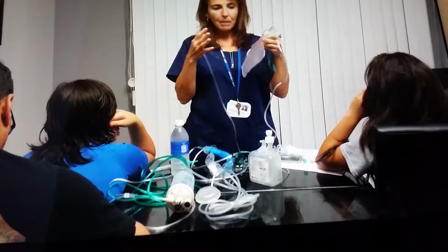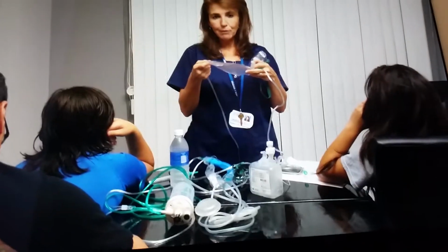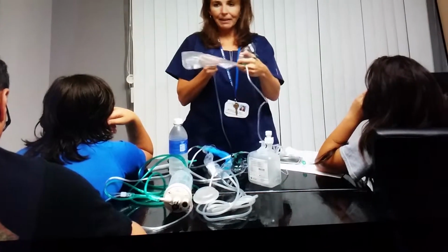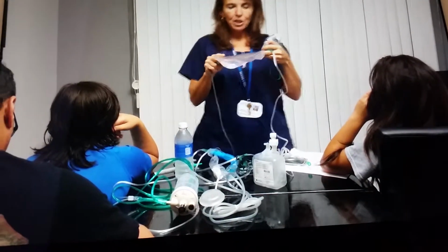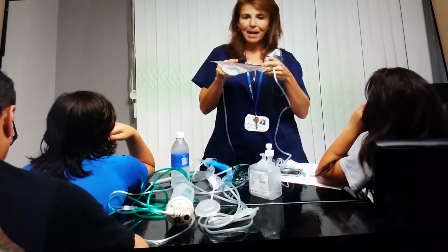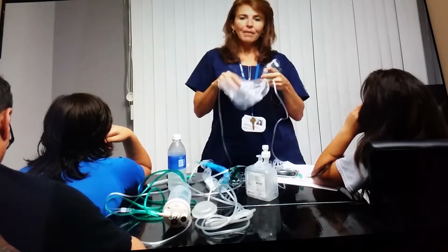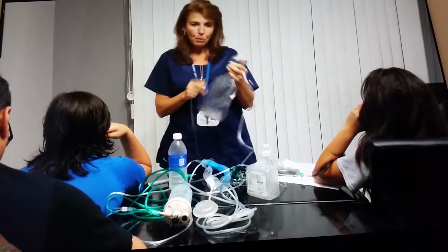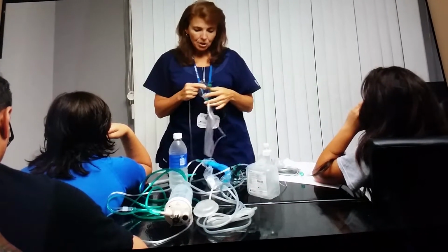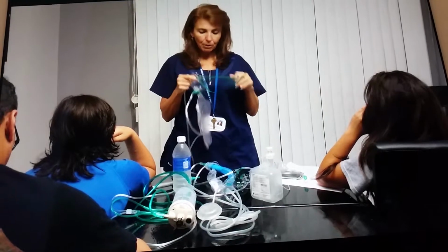If it's overinflated, then you have too much flow. Likewise, if it's flat like this, you have no flow or not enough flow. What you want to achieve is that when the patient takes a breath in, the bag collapses halfway down and then refills as the patient exhales. As I said before, this gives you about 100% oxygen, so it is for the more critically ill patient.